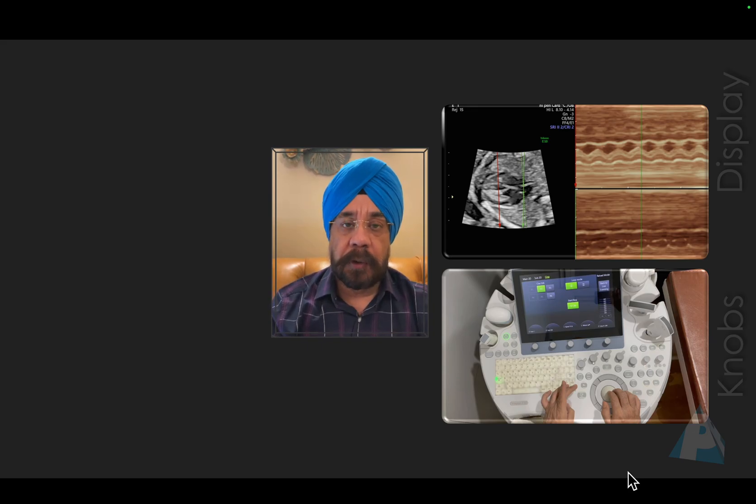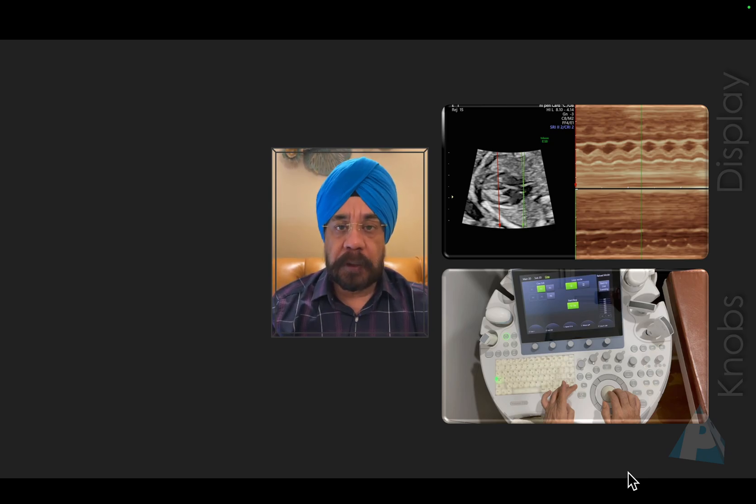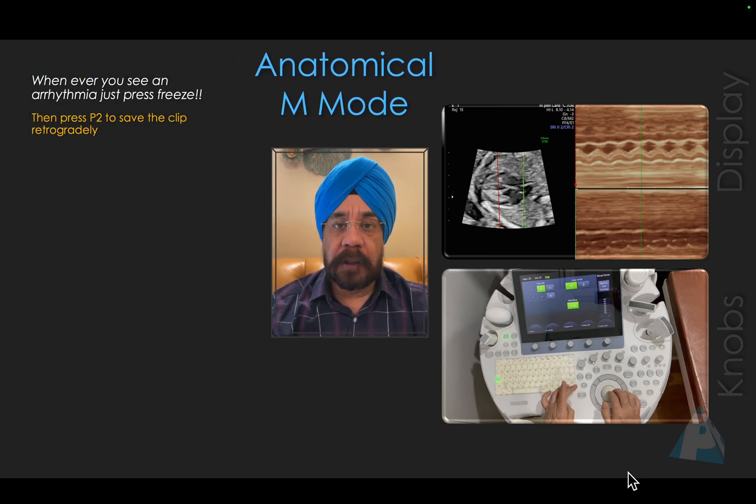I got a request about how to do an anatomical M-Mode on a Voluson or a GE machine like the S10 and S8. Most GE machines support this feature, which I'm going to share with you. I deliberately recorded this video in a very slow format so that it's easy to understand. Let me tell you what anatomical M-Mode is.